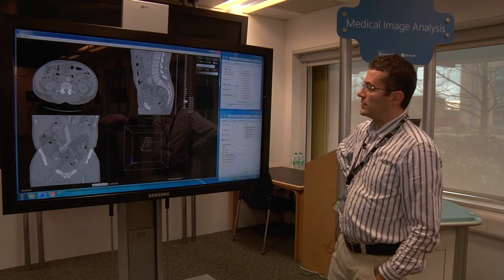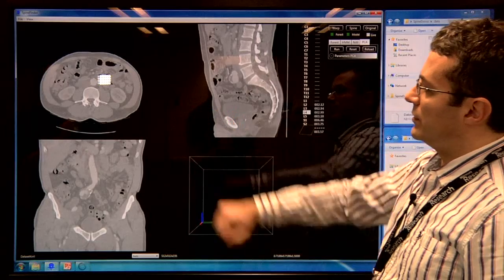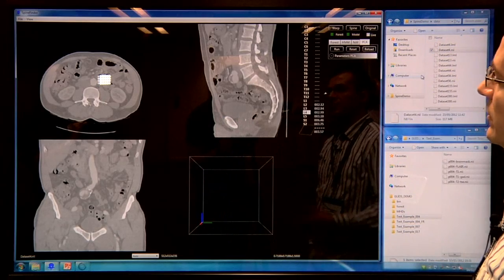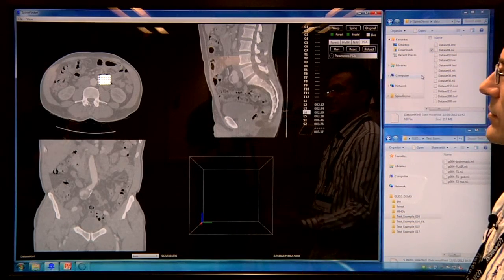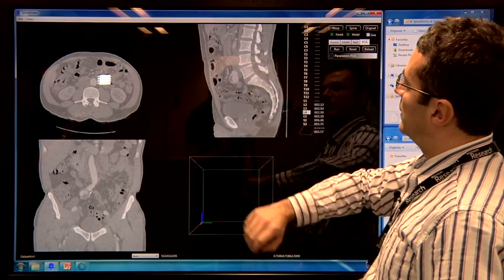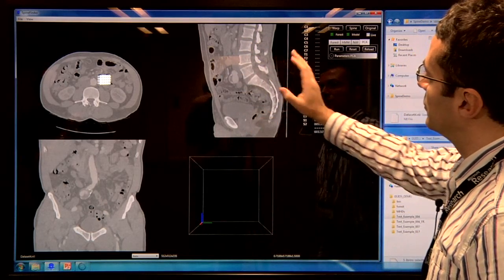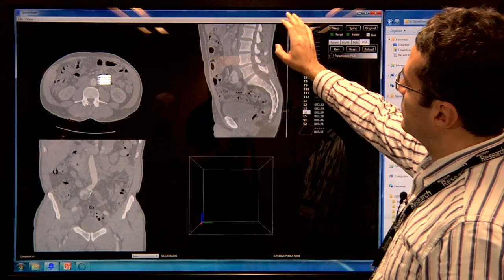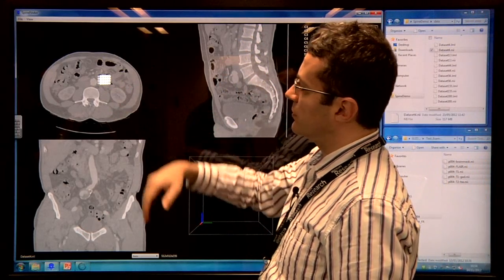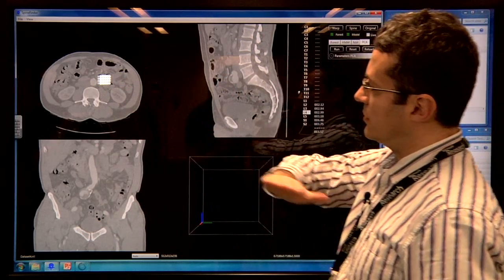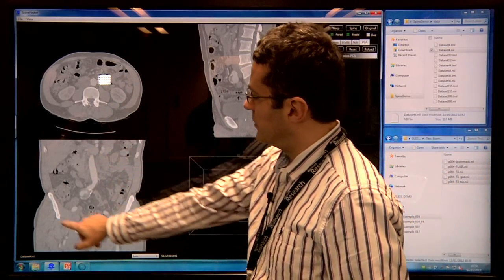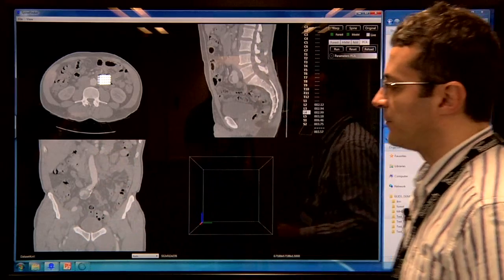Medical scans are like this one we're showing on the screen. This is a CT scan of a patient — CT stands for computed tomography. Even if you're not medically trained, you can see structures like the spine. This is a horizontal view of the same patient, and this is a frontal view. You can see the pelvic region and the aorta.